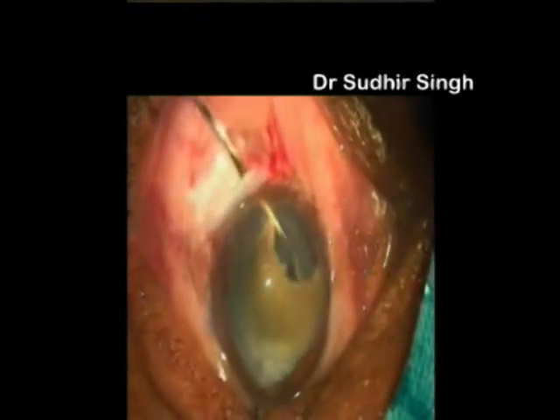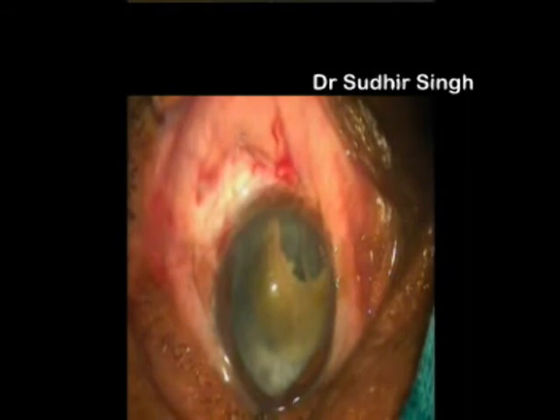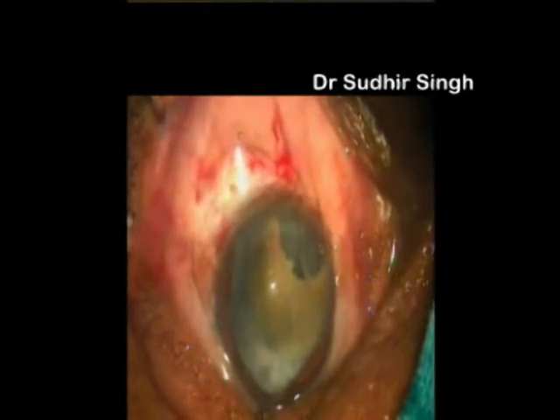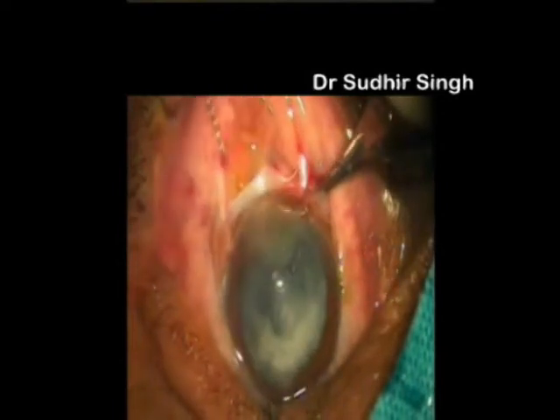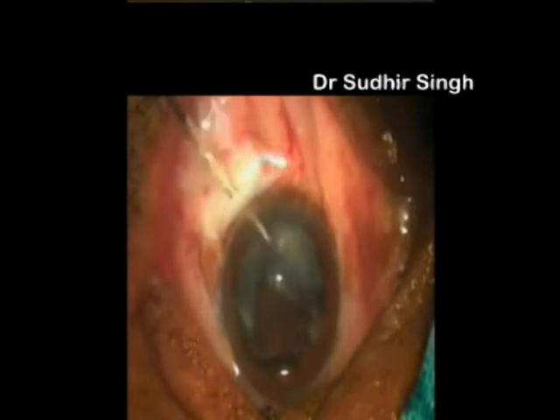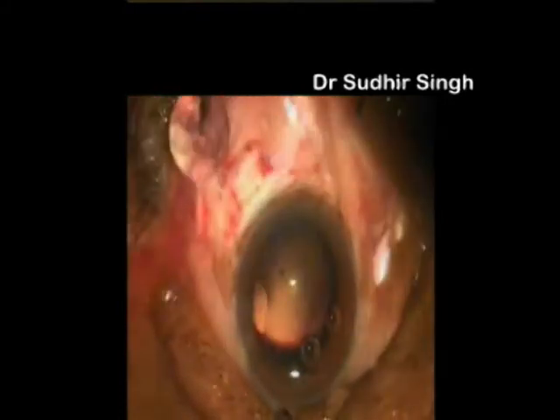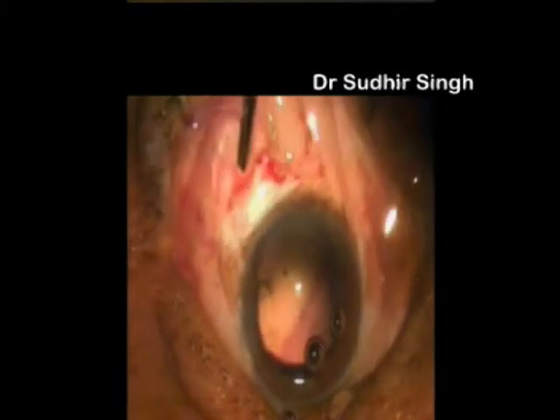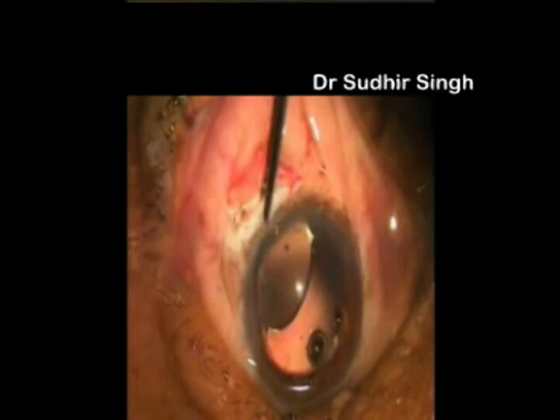The engaged part of the nucleus is pushed back and rotated so its longitudinal axis coincides with the longitudinal axis of the tunnel. The remaining part of the nucleus is taken out slowly from the anterior chamber while the posterior lip of the tunnel is depressed. Remaining cortical matter is cleaned. A single-piece PMMA intraocular lens is implanted into the capsular bag.